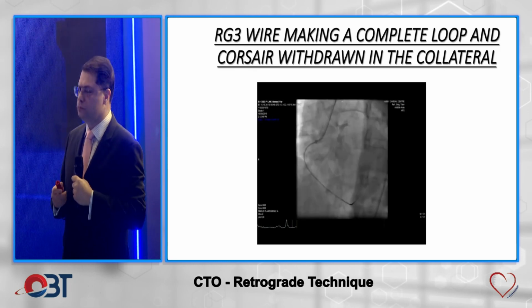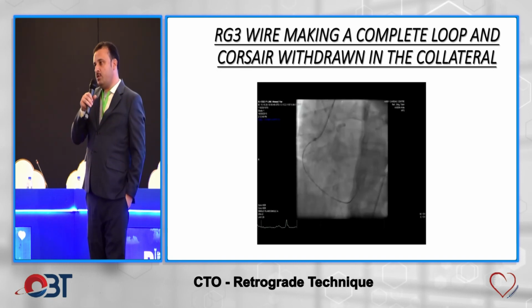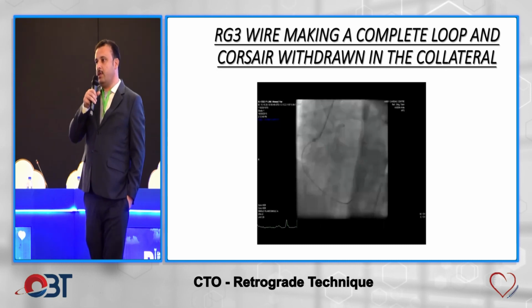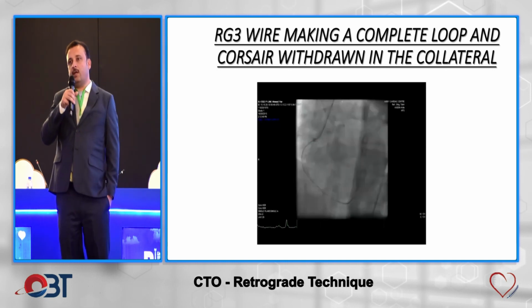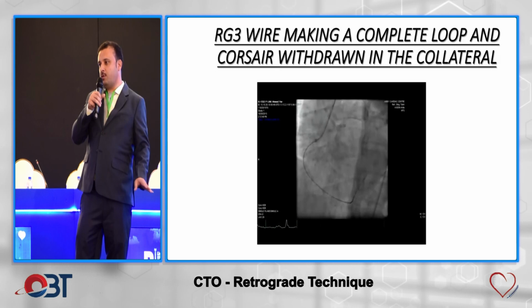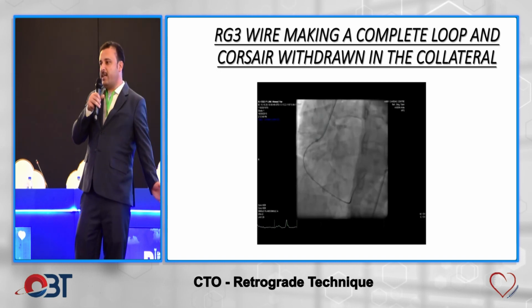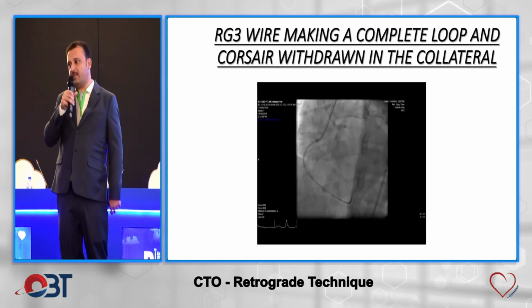Dr. Alam. So we have done a few retrograde cases, in those situations where the antegrade techniques have already failed elsewhere or by myself, and the next go I call the patient and then assess everything, whether the collaterals are good or not, everything is okay. Actually, these are super selective cases, not like outside where every case is taken, any case can be taken for CTO. So these are actually super selective cases of CTO.